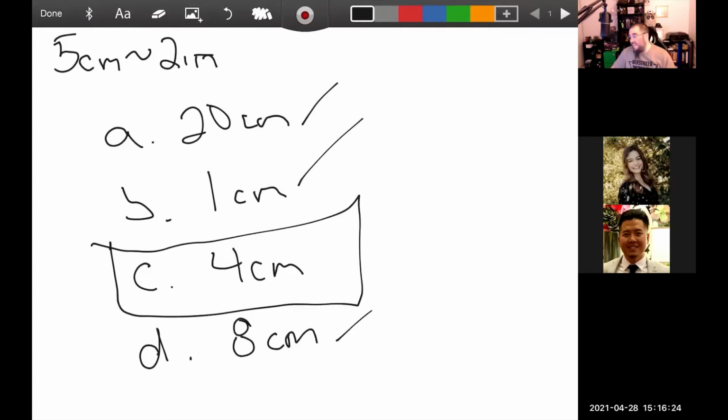Now, if it said something like shockwave, which is not on your boards, because there are no questions about shockwave therapy, so golf clap for that right now. You could theoretically go to the 8 centimeter mark, but they're not going to ask you questions on shockwave. Does that make sense as far as depth of penetration for all of the modalities? Even ultrasound, about 5 centimeters deep is what you're getting. So, about that deep, right? Do I have a ruler handy? Yeah, I do.